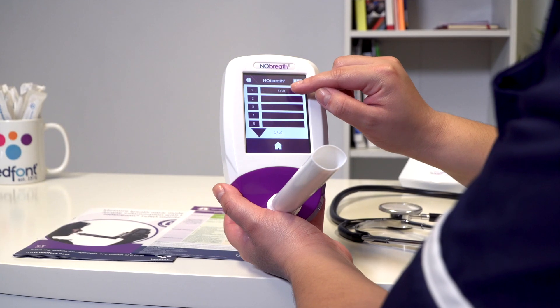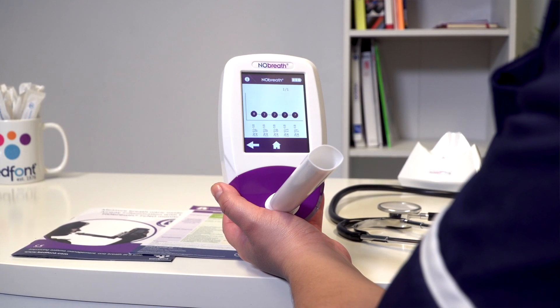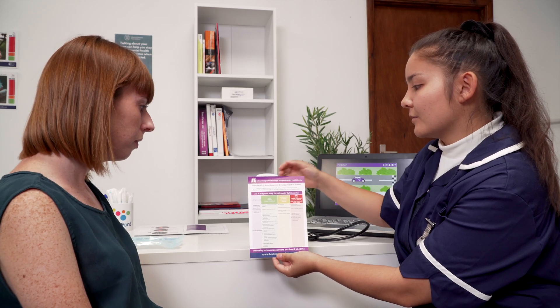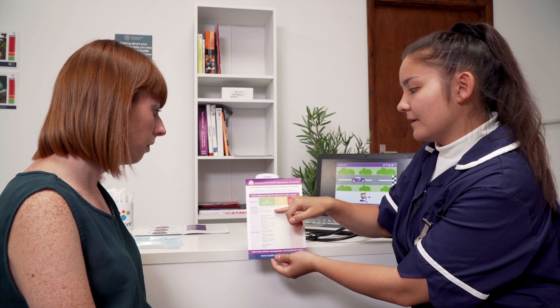Select a profile from the list to add your result to, or select an empty slot to set a new one. Readings and results can be interpreted using the NObreath FeNO interpretation chart.